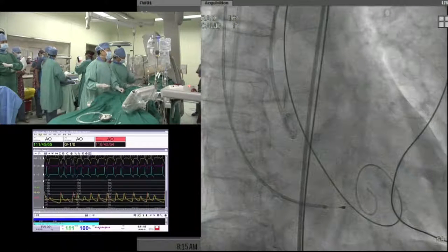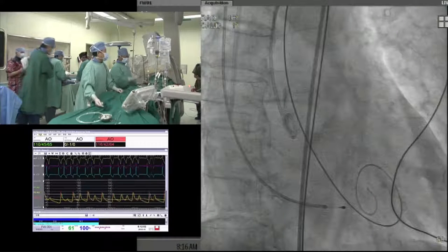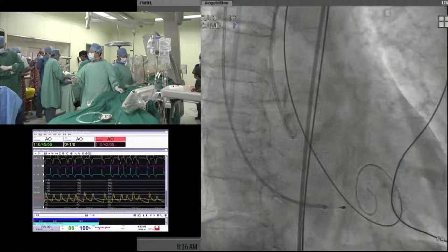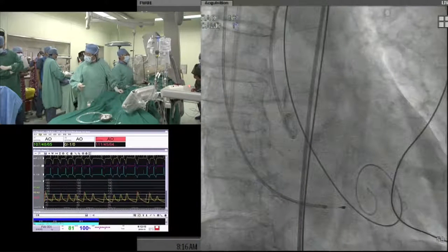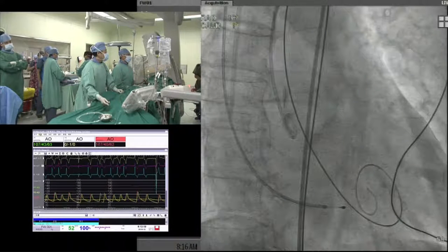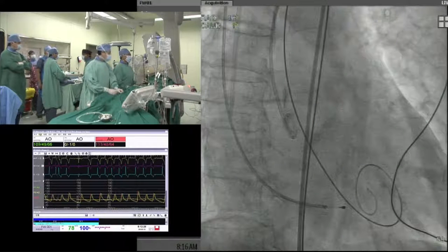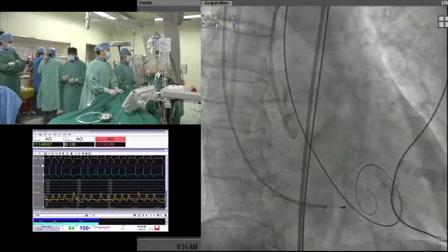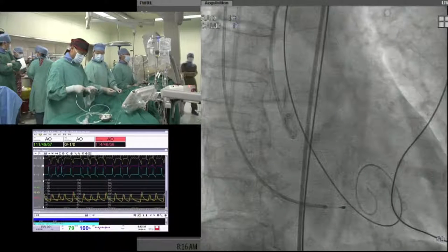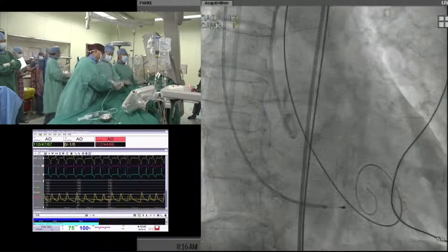Is that because the radial force of the device is not enough, and maybe you had under-expansion in this situation, making the post-dilatation crossing of the balloon difficult? I guess sometimes the price you pay for not pre-dilating is more difficult crossing, with maybe embolization and stroke with that, and maybe more difficult positioning because there's so much stenosis when you're positioning. So in some patients, I think it helps to pre-dilate, but the trend is towards less and less, isn't it? I'm just talking about the metal in this device seeming to be less than that of the CoreValve or other devices. So maybe the radial force is not enough. It's hard to know.